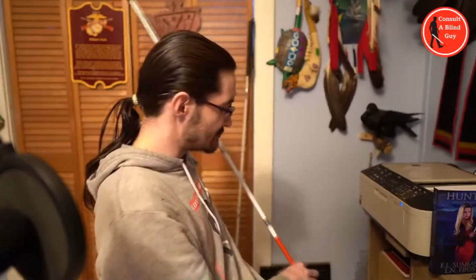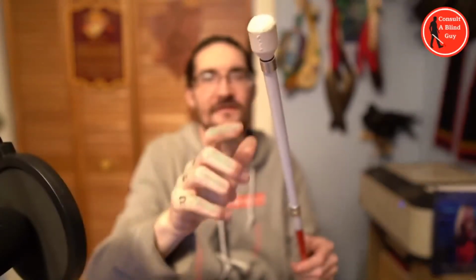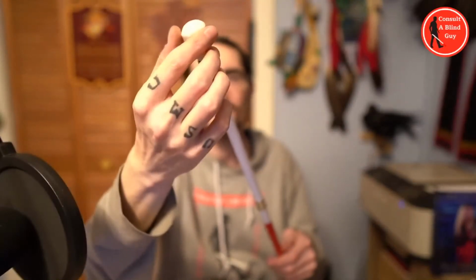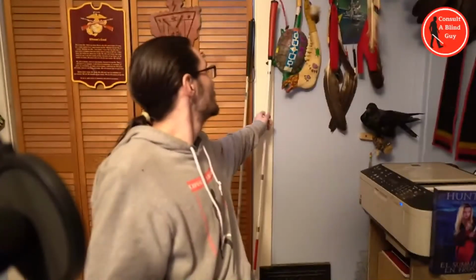This is my no jab cane here. The no jab cane comes with a marshmallow tip, non-rolling. I've only had this cane for about 8 months, roughly, and it's already starting to wear on the very edge, as well as a little bit further down on the side, from the way that I swing my cane. It works, but I still prefer the roller tip.